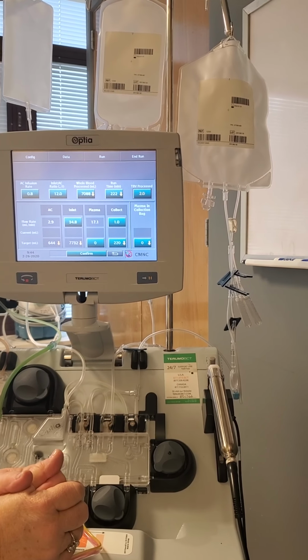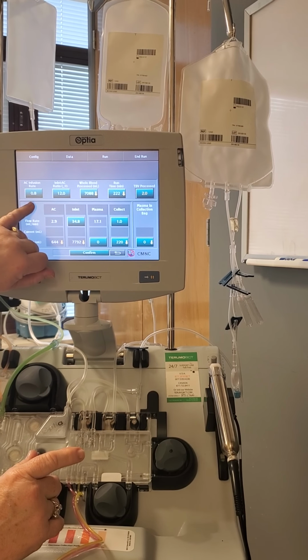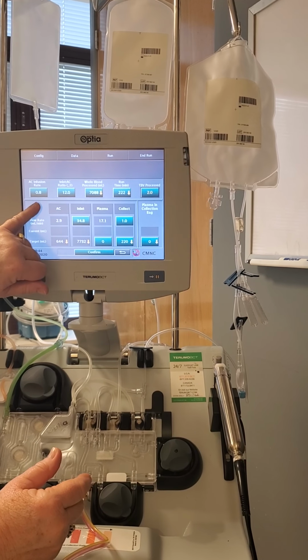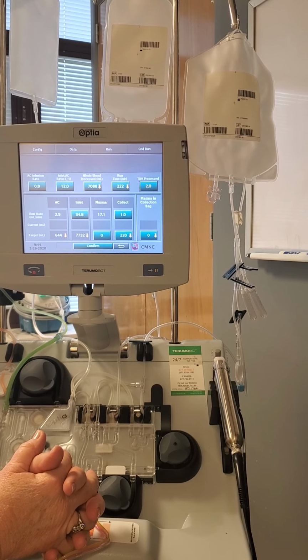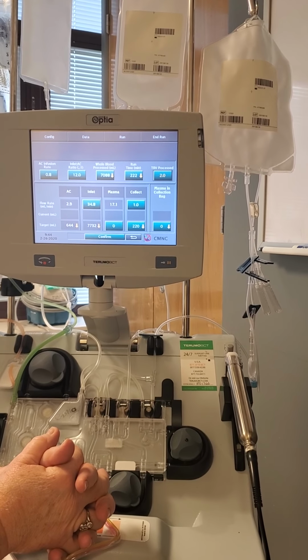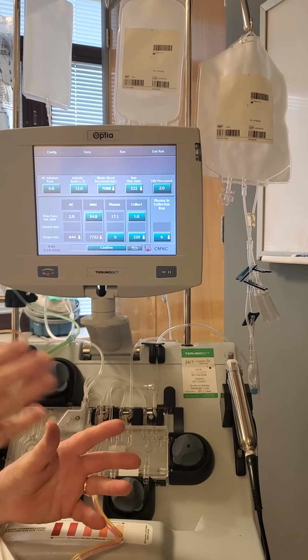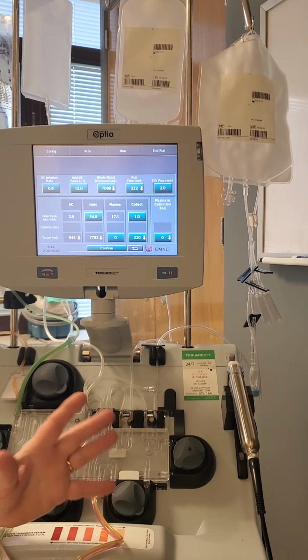All right. Now, the other thing we did yesterday was we raised the AC infusion rate to 1 mL/min to get things to happen faster. I think today, in the interest of time, let's just start off at that conservative AC infusion rate until we understand the AC management here, okay? So we'll leave that as is. So really, we did nothing to this screen. We looked at the numbers. This is what popped up for you, Blanca, for your collection today.